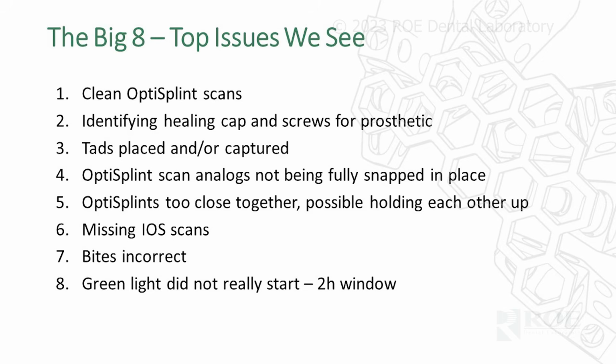And be sure to place TADs and capture them very well. We covered that. The scan bodies that you put into a prosthesis, they must snap in, right? That's more of a restorative protocol, but if a patient has a prosthesis and you're putting the analogs in, make sure that they're all the way down. Because if they're not, then we have that implant in a wrong position, and it's just a big question mark, or we'll get the tissue wrong in that area.